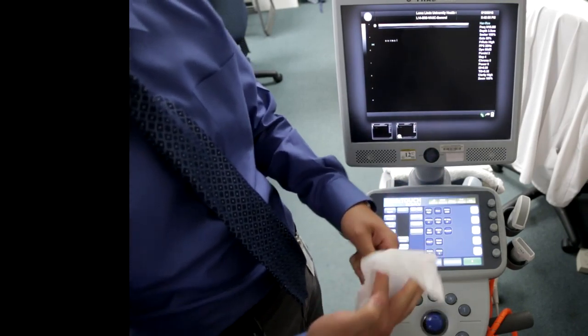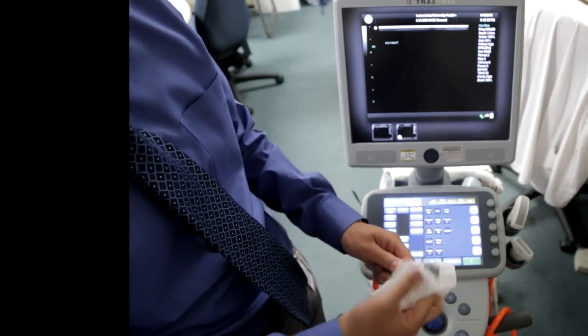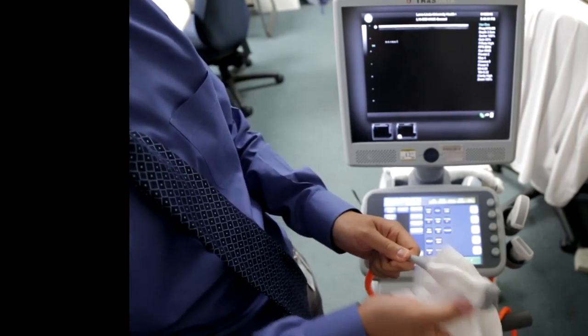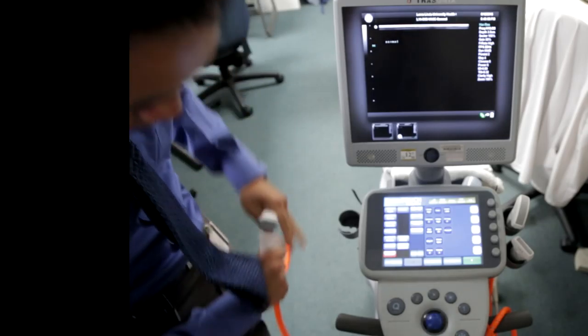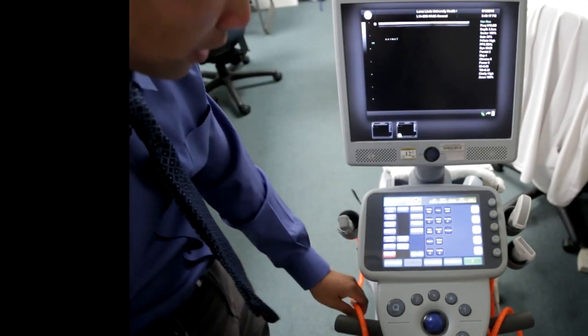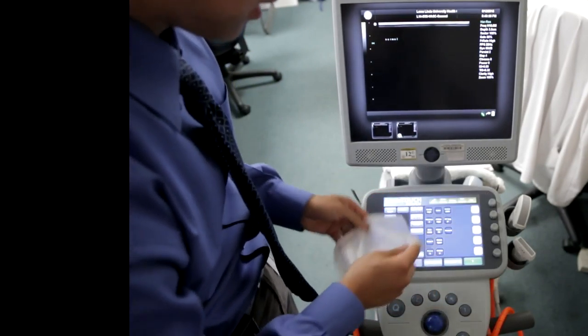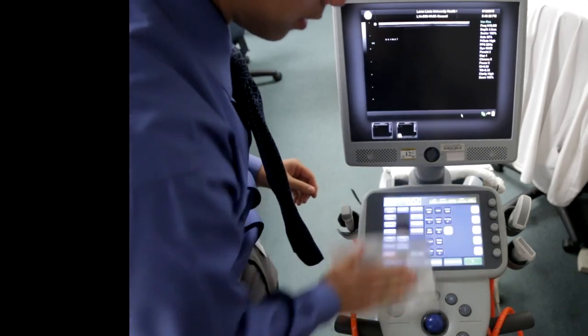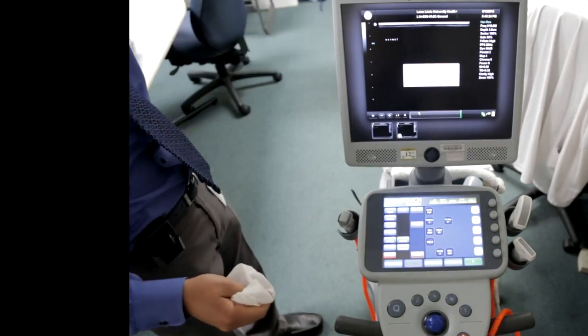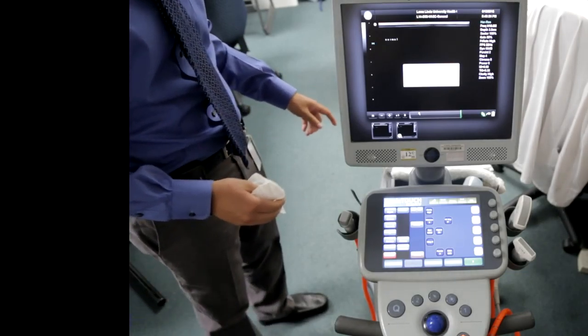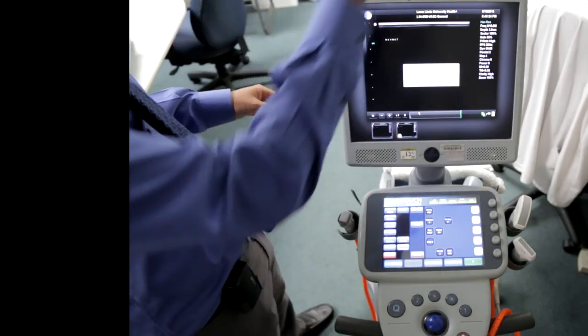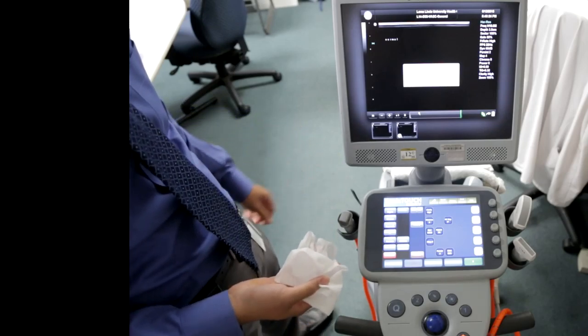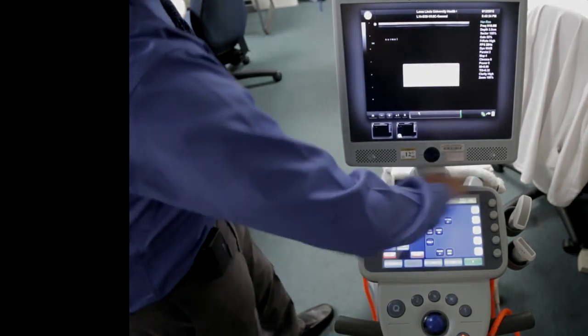You're going to clean the footprint of the probe, the actual probe itself. Clean the whole wire all the way to the base, then make sure you clean the keyboard and any buttons that you push. Unplug the machine from the outlet. Make sure you clean the cable also, because that's touching the floor and can be pretty dirty.